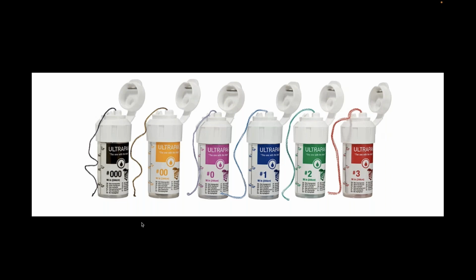So you prep a tooth, you take the scanner out, and you start scanning. What's really being missed is we still have to manage the prep position, the marginal finish line, and we still have to move the tissue out of the way to be able to get the tissue where we need it to be to capture the information and the impression.